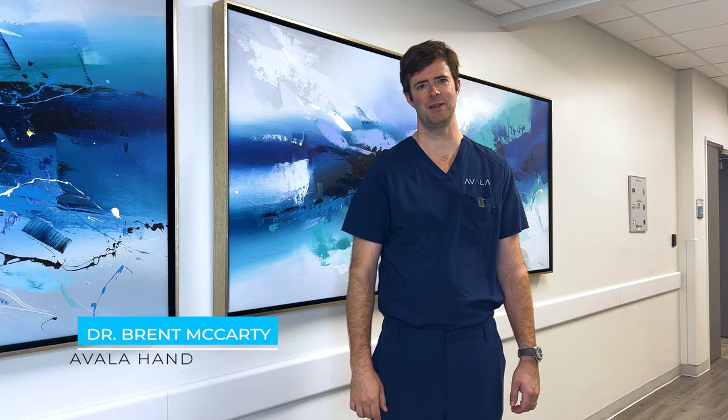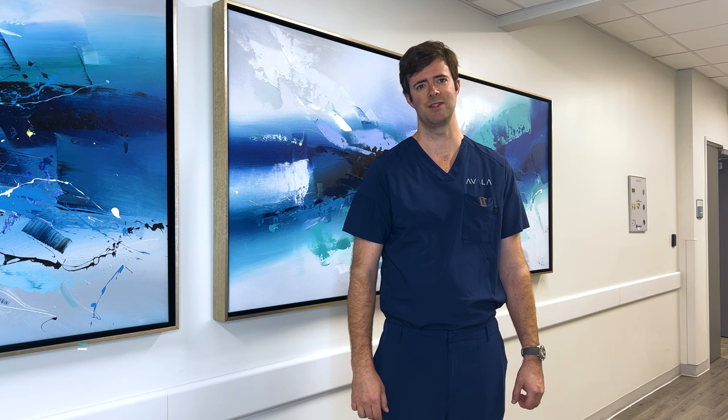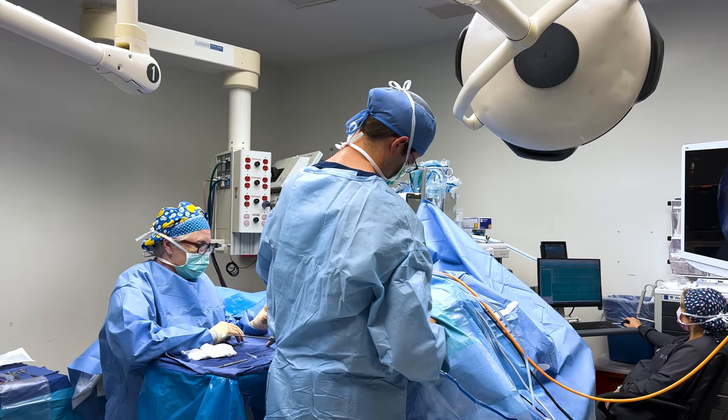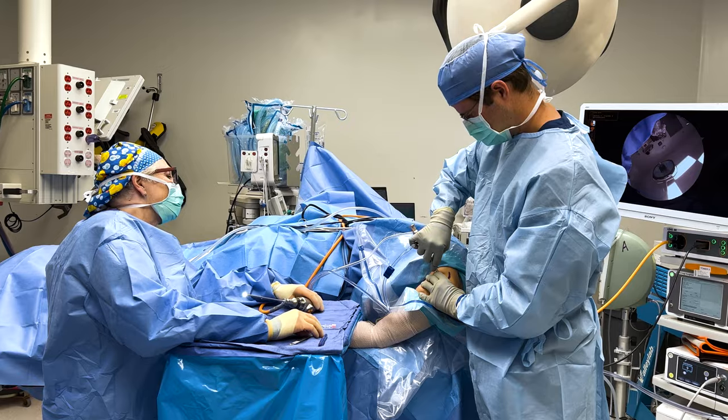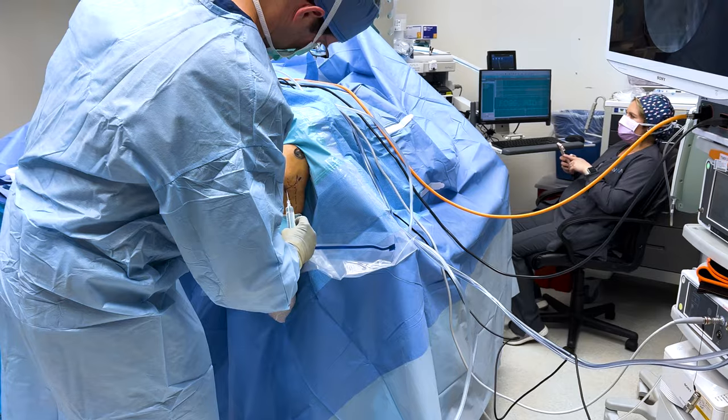Hey, this is Dr. McCarty. Today we're going to take you into the operating room for an elbow scope. This is one of the less invasive procedures for tennis elbow. First we will make several very small incisions for the scope's camera and our surgical instruments to get into the elbow joint.